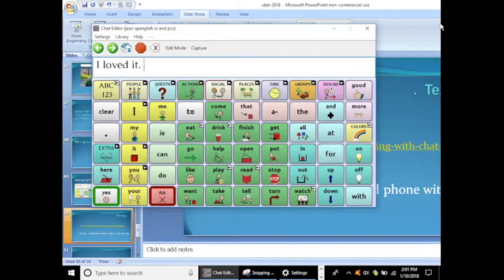I can't do this backwards, sorry, that's hard. To give you an idea, I can say, I am eating. Okay. And so I have that, and this is what I'm going to say to her, because we seem to talk about food. And then I'm just going to hit that send button. She'll be getting a text right now.